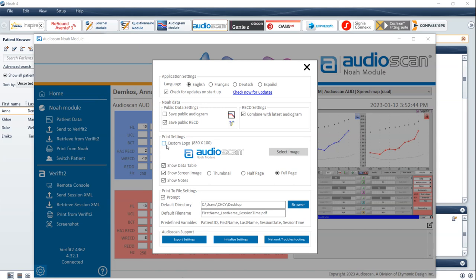Print settings for the AudioScan NOAA module generated reports can be configured. You can add a custom logo, a data table, choose the size of the AudioScan equipment screenshot, and choose to show your notes on the report. Print to file settings for PDFs can also be configured. These parameters can be adjusted as needed to allow compatibility and report integration with Office Management software. For users that would like to set where reports are saved and how reports are named, change the default directory and default file name. Please refer to your Office Management System user guide regarding automatically setting the import folder for external PDF reports.